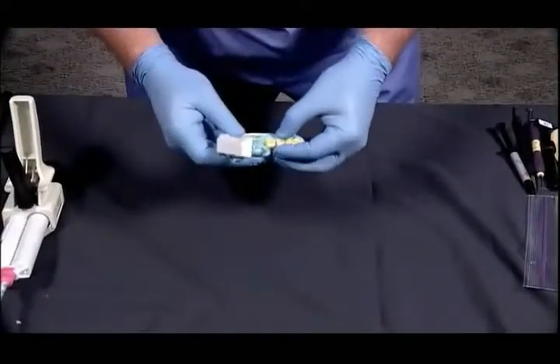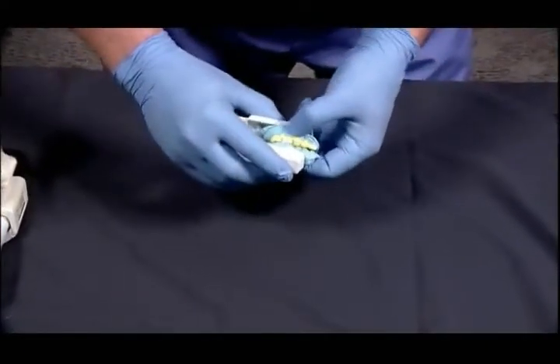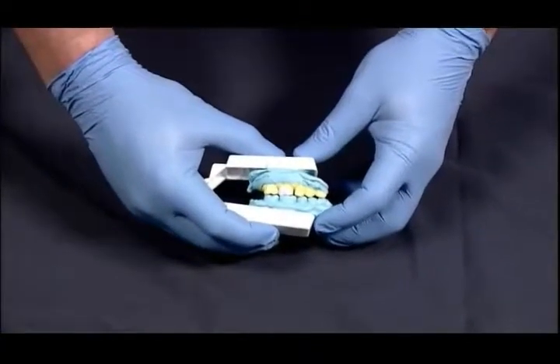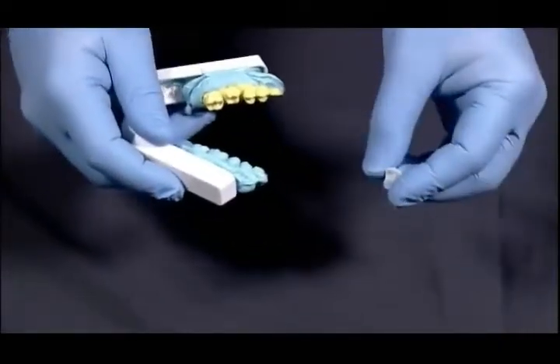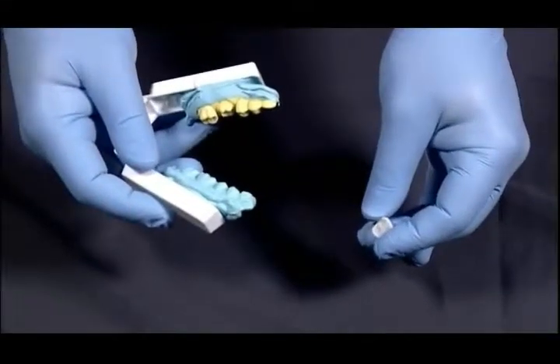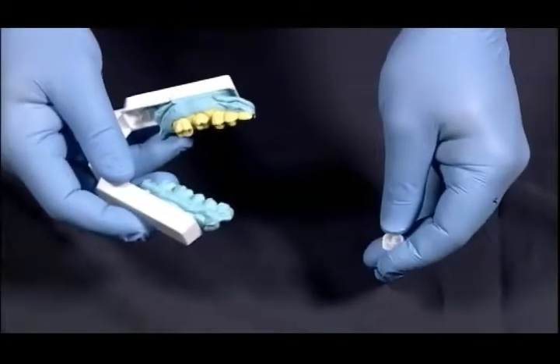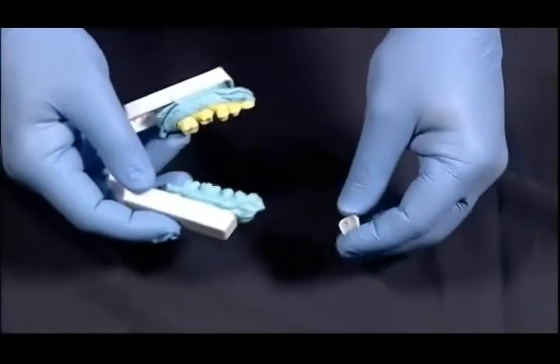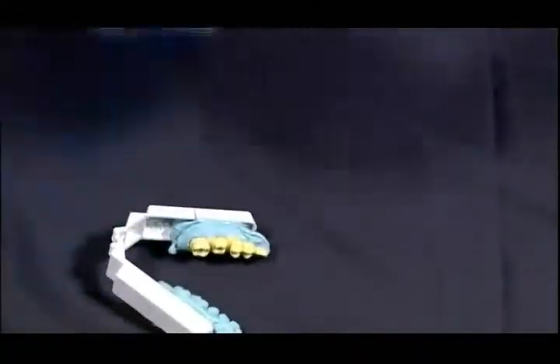All right, we're back from trimming up the Direct Crown Natural1. From here on out, I'll probably just call it the Natural1 crown form. And you'll see that I can articulate the model to its full articulation. At this point, what I'm going to be doing is sandblasting the internal aspect of the crown. So using a micro aerabrator, of which there are many good ones out there on the market, or an abrasion unit in your operatory, if you happen to have that, your assistant, I should say, will be aerabrating to roughen up the internal surfaces of the crown shell.